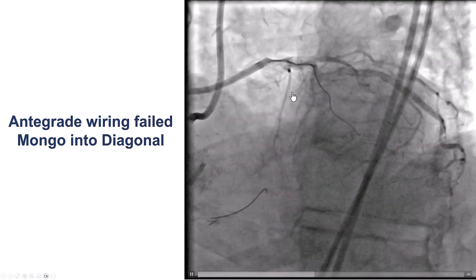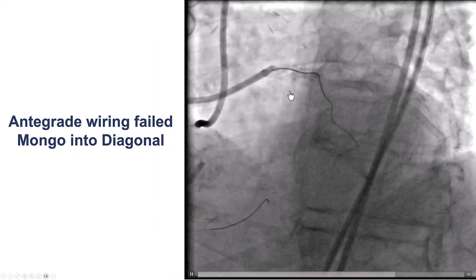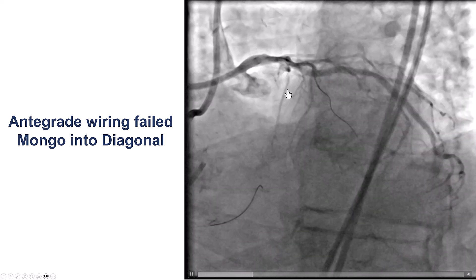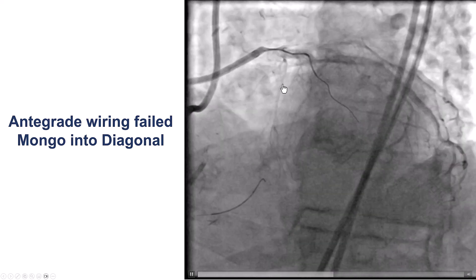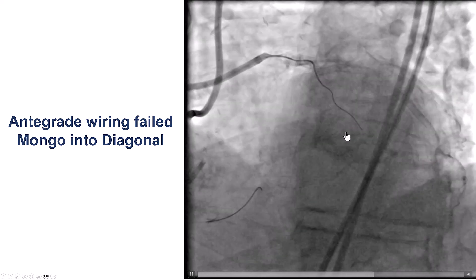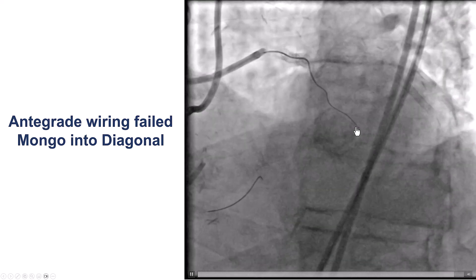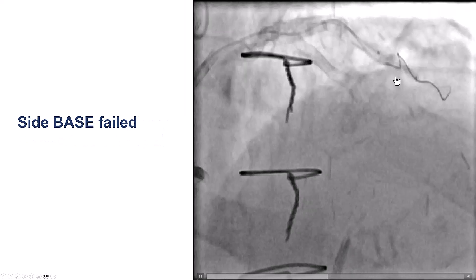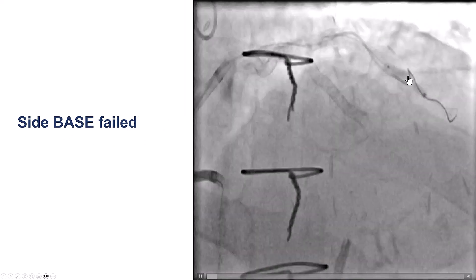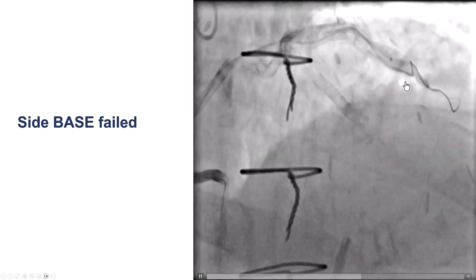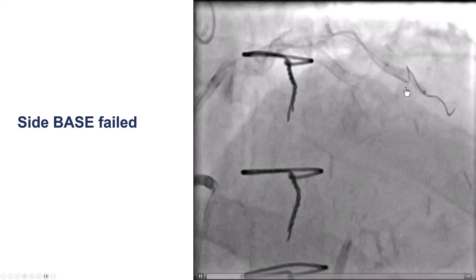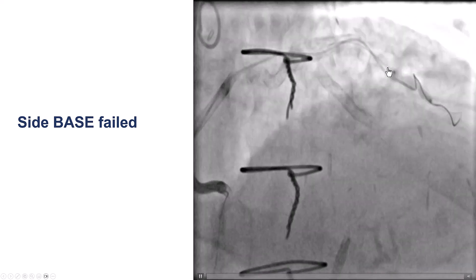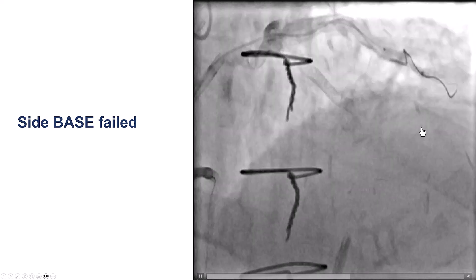We decided first to try to cross using antegrade wiring or dissection re-entry in a short segment. We used the Gladius Mongo, but this kept on entering into a diagonal branch of the proximal cap. We did the side BASE technique — put a balloon in the side branch and tried to advance a guide wire along the course of the LAD — but we were unable to get a knuckle going down the LAD.